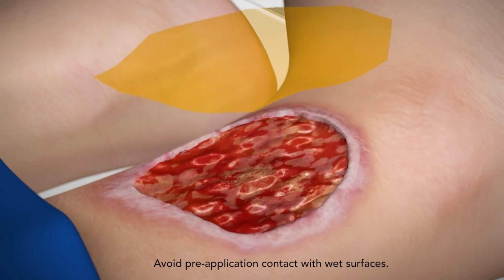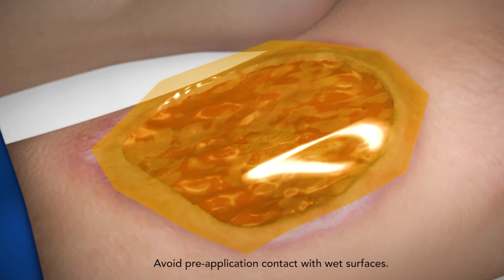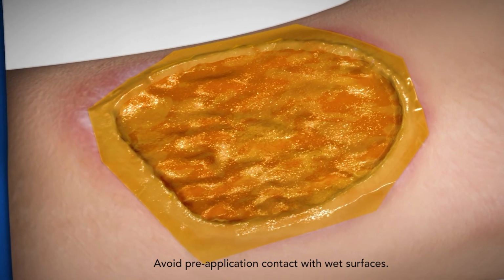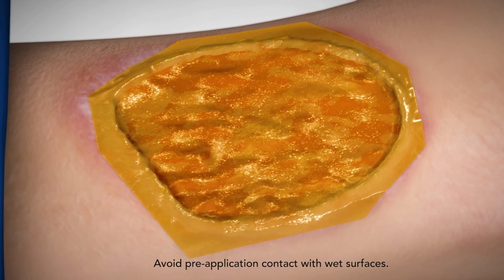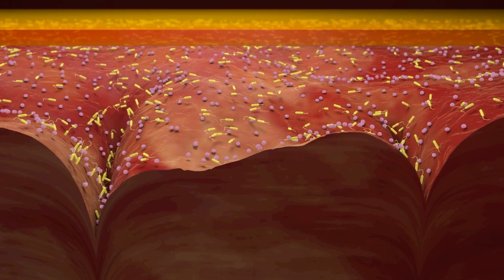For large wounds or irregularly shaped wounds, it may be tiled across the wound bed surface. The matrix should be cut to a size slightly larger than the wound to overlap the wound edges. Apply SAM directly to a moist wound bed. If the wound is dry, use moist gauze and apply light pressure to the matrix in the wound bed to achieve maximum conformity to the wound bed and edges.